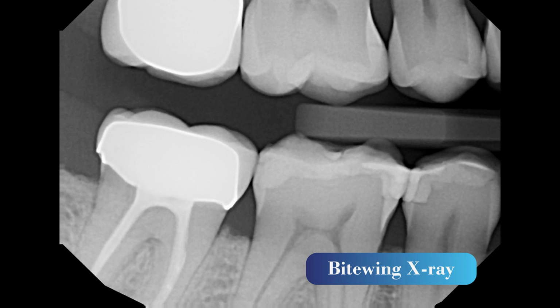So here on number 31, you can see that the patient has a root canal, and then they also have a crown. This looks like a porcelain fused to metal crown. And then the same with number 2, a porcelain fused to metal crown. And then on 29 and 30, they have some composite, like resin type filling material that's been placed. So you can see the restorations and check the health of those with bite wing images as well.